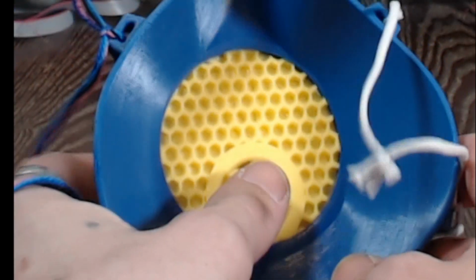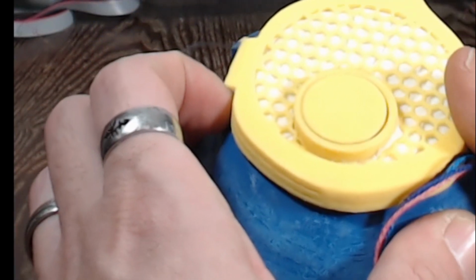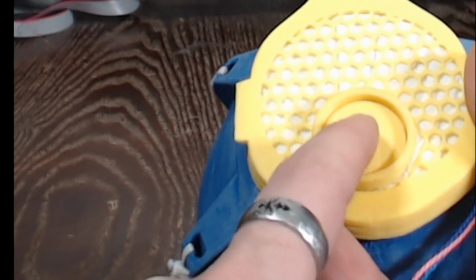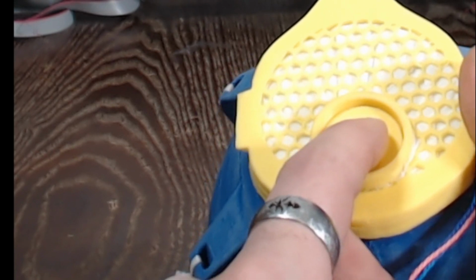Now, obviously, this is temporary, and this actually came off an old mask that I had laying around. So this does need a little bit of adjusting. There is a spring in there so that it pops back after you breathe out. It will expel air and then pop back closed. Now, I do need a 25 millimeter O-ring with a 25 millimeter outer diameter to go in there to ensure that it is an airtight seal.